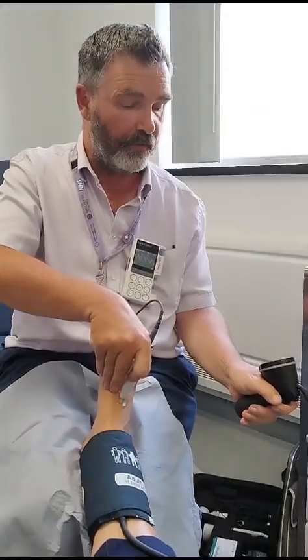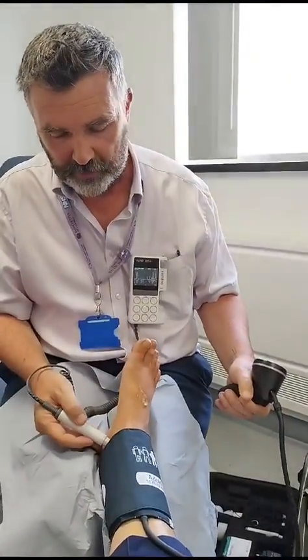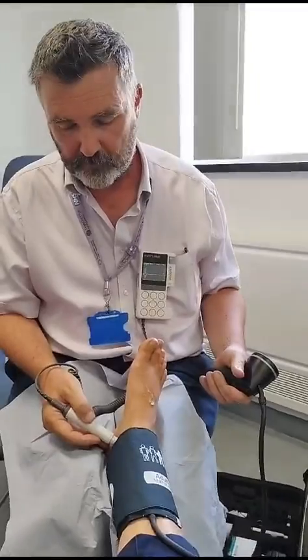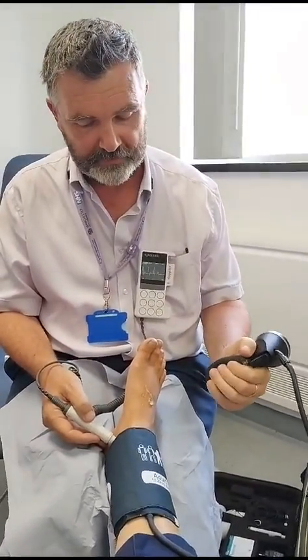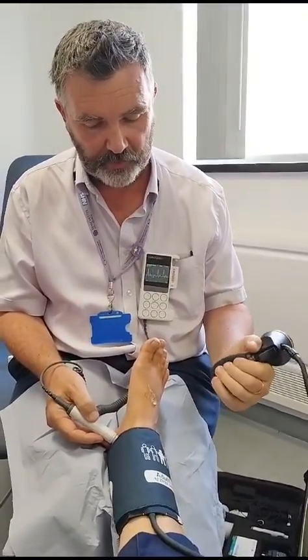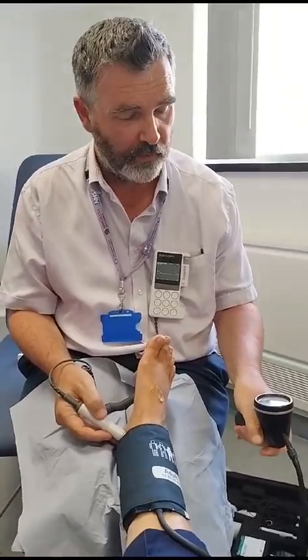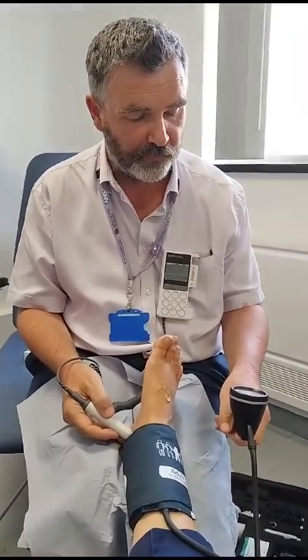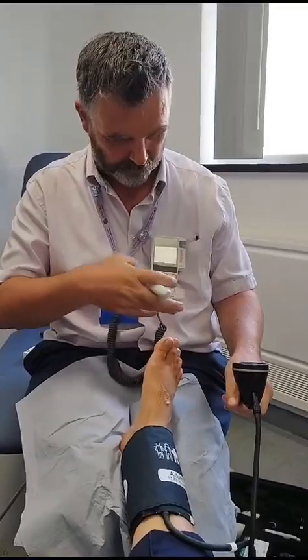The dorsalis pedis came back at 110 mmHg. Then I'll go to the posterior tibial pulse. Once I've found an audible pulse, I'll close my trigger and inflate with nice steady compressions through the bladder. One more pump after the sound's gone, then deflate slowly with a finger on the trigger, waiting for the first sound to come back. That came in at 145 mmHg. How long did that take? About two minutes.